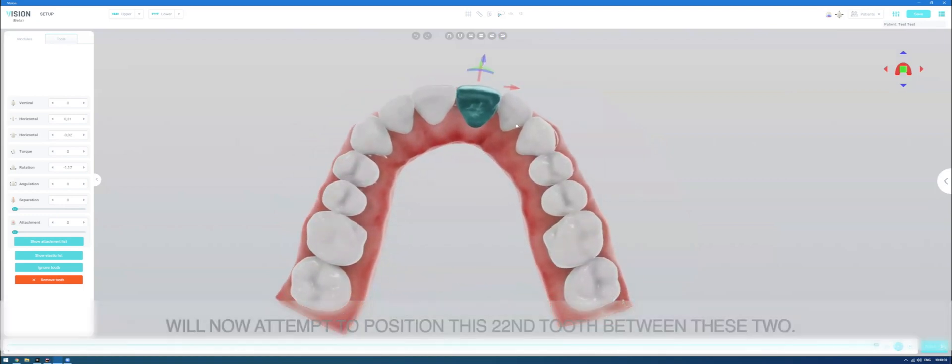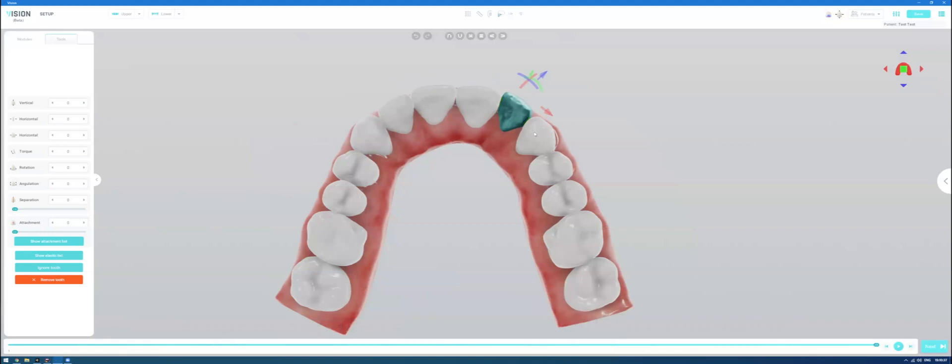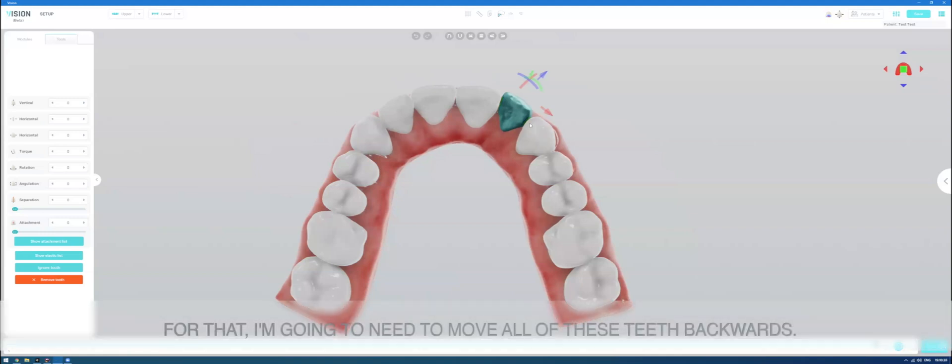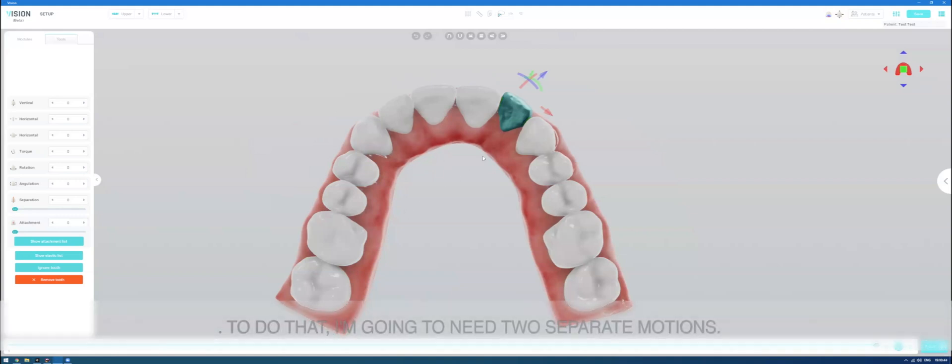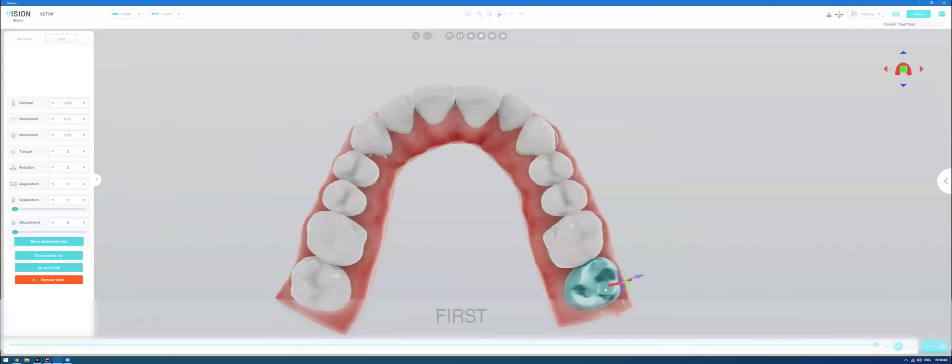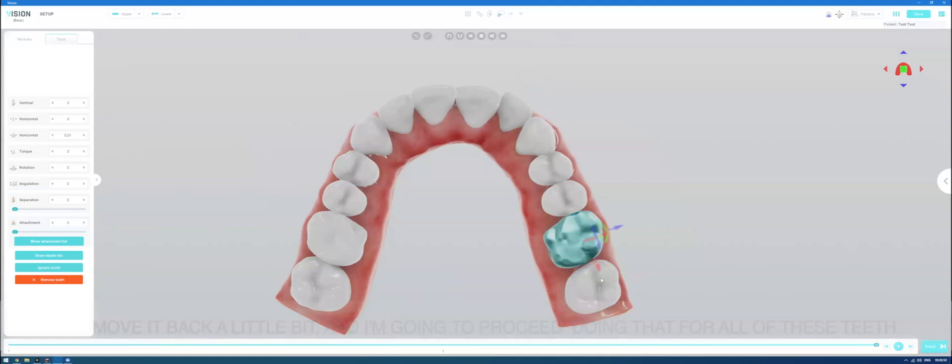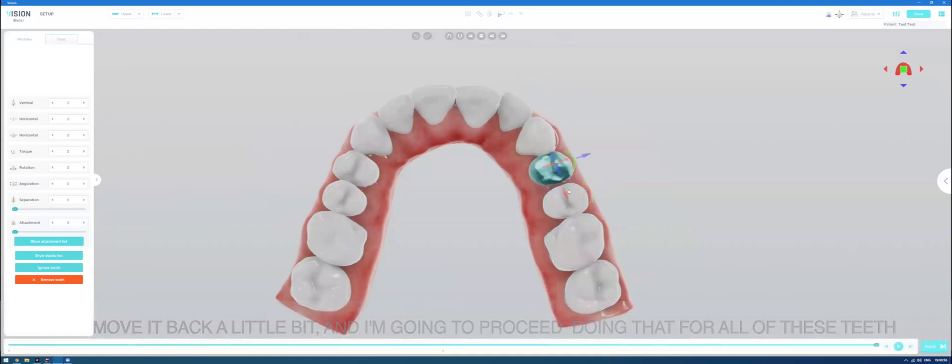I will now attempt to position this 22nd tooth between these two. But for that purpose, I'm going to need to move all of these teeth backwards. To do that, I'm going to need two separate motions. I will first select this tooth, move it back a little bit and I'm going to proceed doing that for all of these teeth.